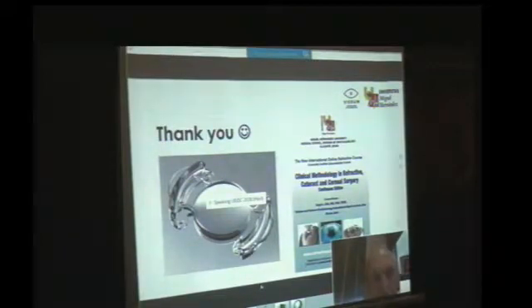Okay, thank you. Answering the second, this was from the very beginning our target, to demonstrate the safety, and we had not a single case of UGH, uveitis, glaucoma, hyphema. It could be expected in cases in which the lens is rubbing against the posterior side of the iris or the sulcus. Not the case of this lens. Consider also that this lens is especially designed for the sulcus, so this was very carefully excluded from the beginning. But the fact is that 10 years following the initial implantations, we have not one single case with a glaucoma uveitis hyphema syndrome at all.